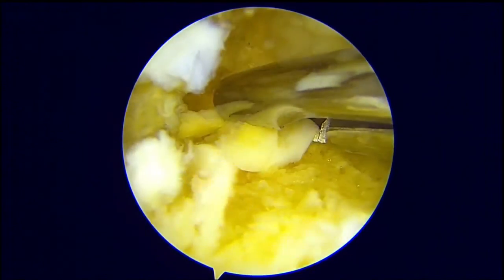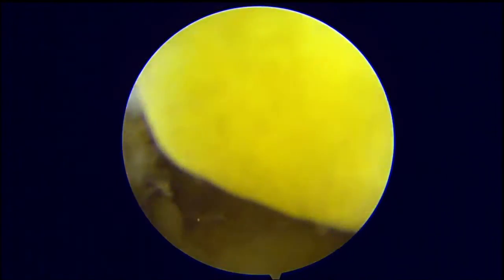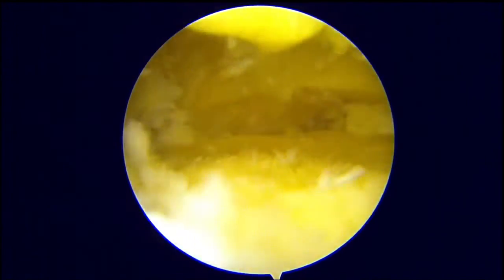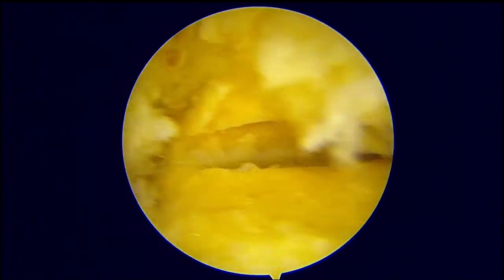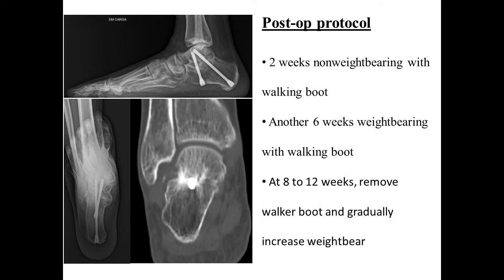We remove the large fragments of bone and cartilage. If small fragments of cartilage are left inside, there is no problem. This is the final aspect of the subtalar joint, and after this we place our screws.